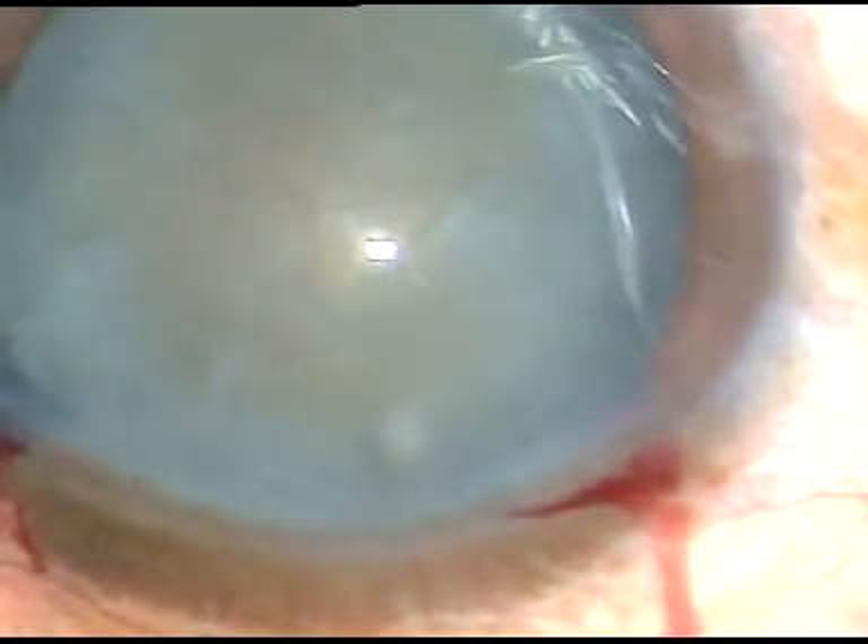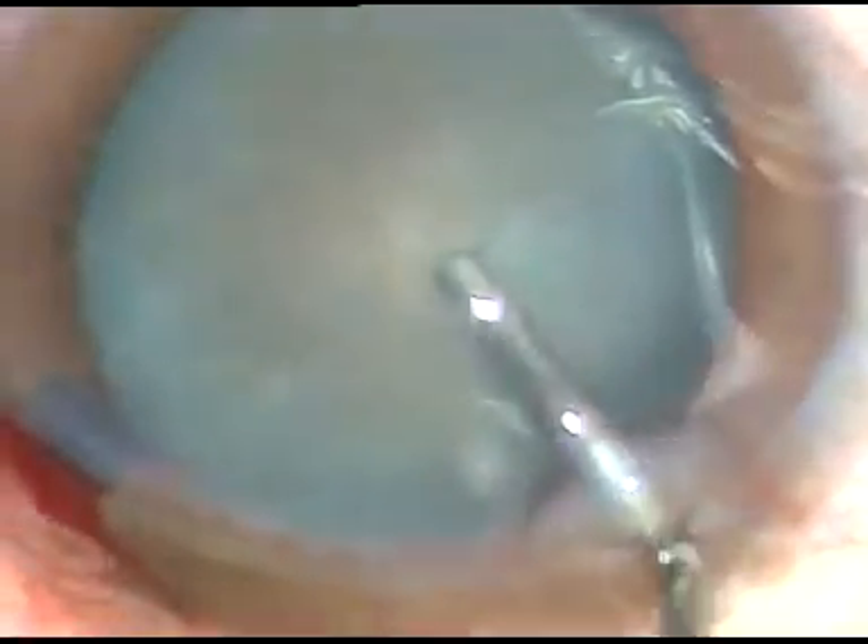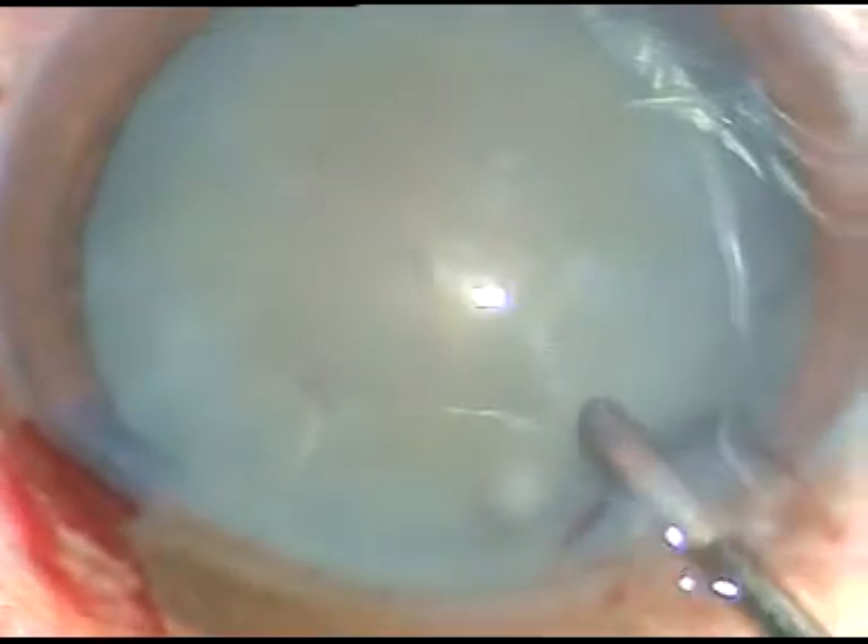Dear colleagues, in this video I am going to show rhexis and nucleus management in two non-intumescent white cataracts.